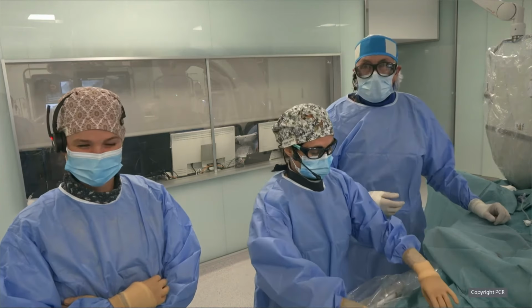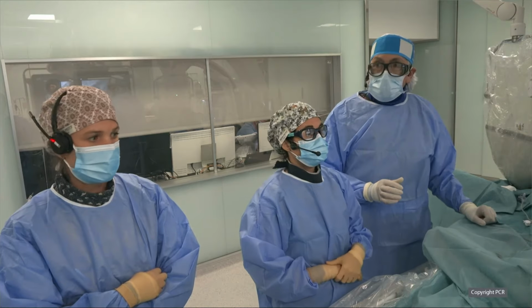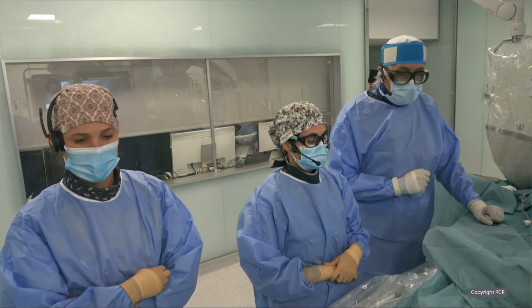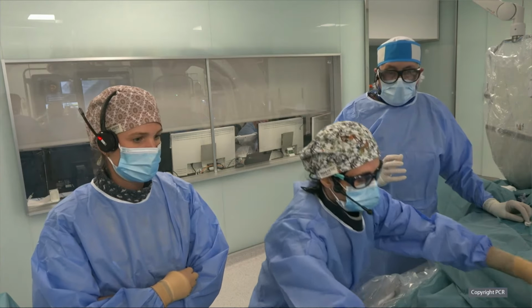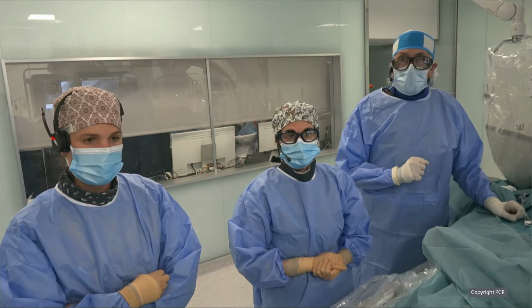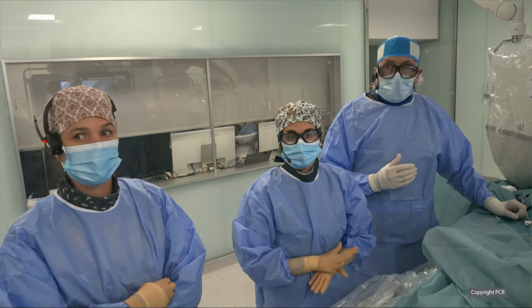We've been following with a lot of interest what you have been telling us, and I must say that Peter O'Kane nailed it. We are radial approach, 7 French, IVUS, and this is the scenario that we're using to start with. Now, as you rightly said, Emanuele, in complex cases like these ones, we like to have sometimes the concourse of CT angiography, and if we can have the picture that we obtain in these patients, you will see why this, before having the OCT imaging, also helps us in deciding.